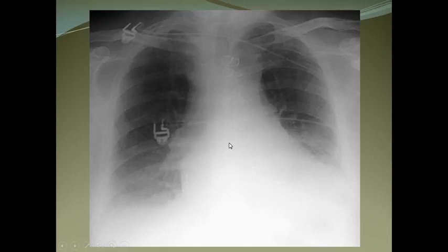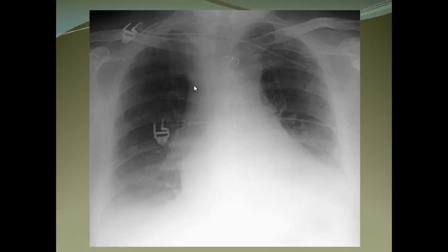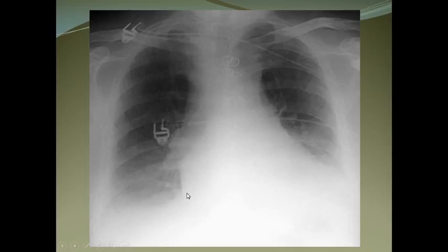On the AP X-ray, it seems to show cardiomegaly, a large heart, bilateral effusion, and widened mediastinum suggesting mediastinal injury — but this is not actually the case. This is an AP X-ray, and we are misinterpreting things because of it. You can see the much straighter clavicles and ICU wires.